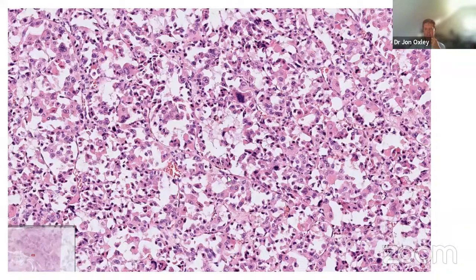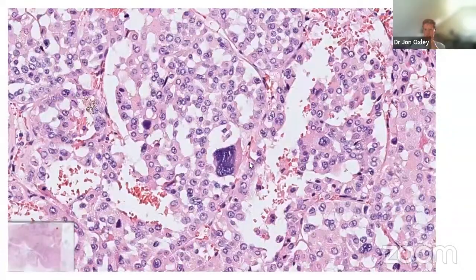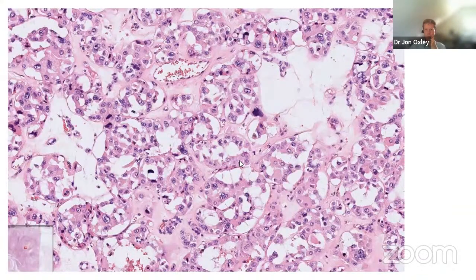And it looked like this. Sort of glandular structures almost, which were falling apart. And occasionally some very large, bizarre nuclei or giant cells. There was some vague vacuolation, but whether this was degenerative changes or poor fixation is unclear.